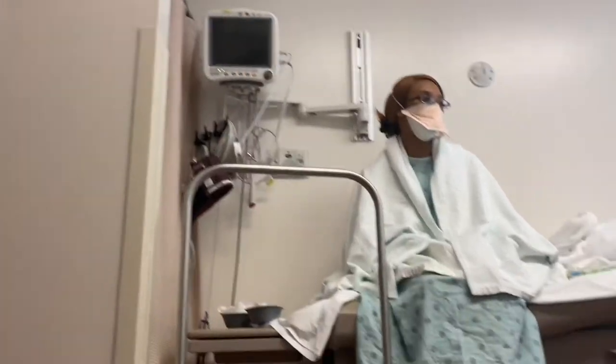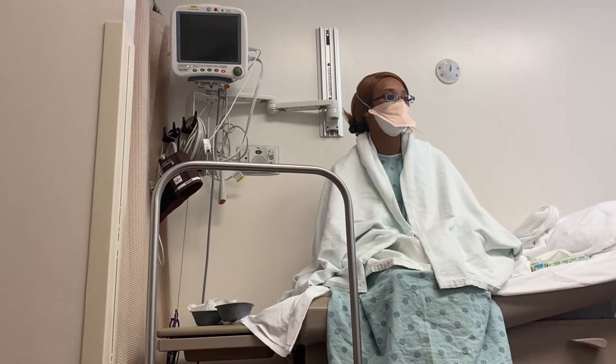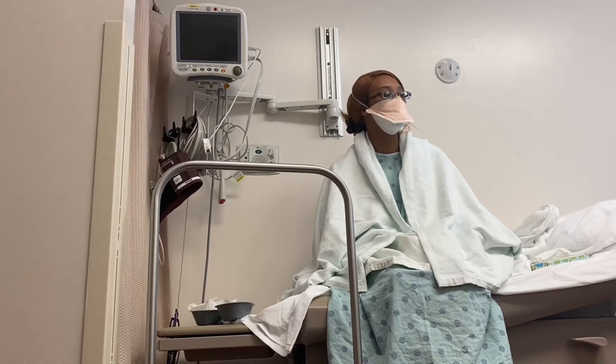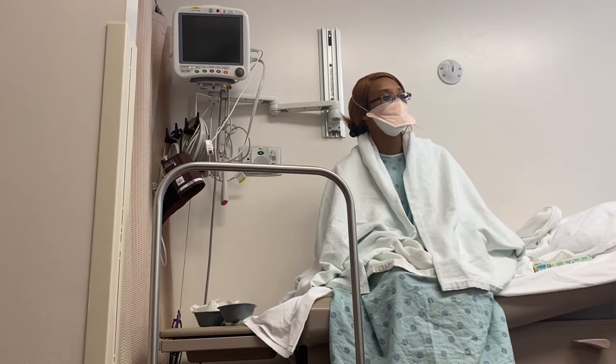How are you able to measure? It gives a report. I'm sure it has little sensors on the tube that look for acid, and little sensors that look for non-acid. When we download the data tomorrow, it'll come as a report of what it read from those sensors. Okay.